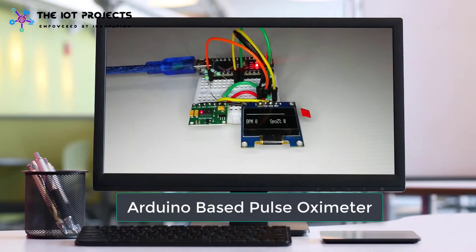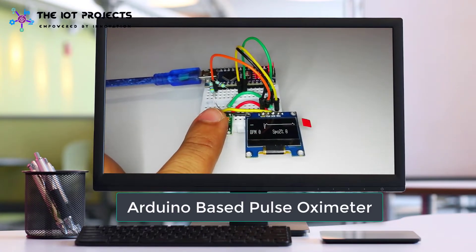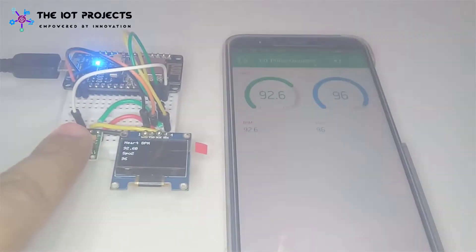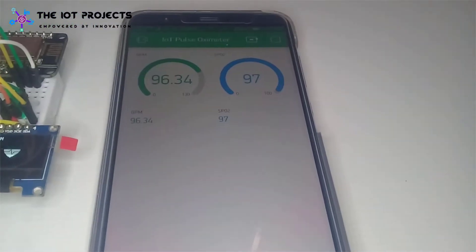In our previous project, we made a compact Arduino-based pulse oximeter in which pulse rate and SPO2 level are shown on an OLED display. But in today's project, we can monitor those values from anywhere in the world using the Blynk IoT application.